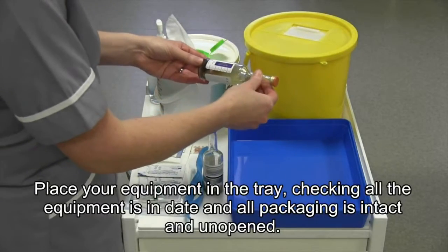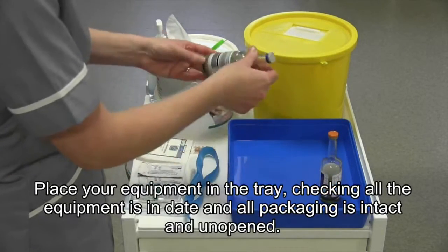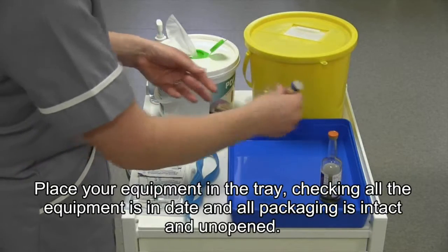Place your equipment on the tray, and check that all the equipment is in date and all packaging is intact and unopened.